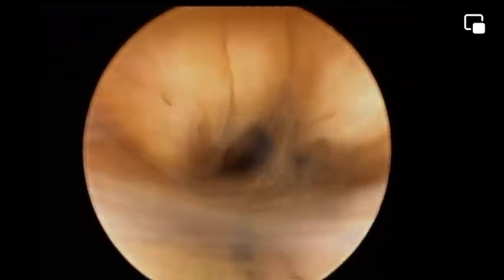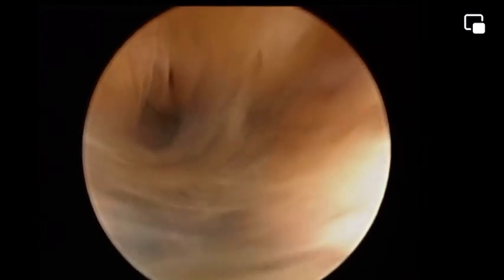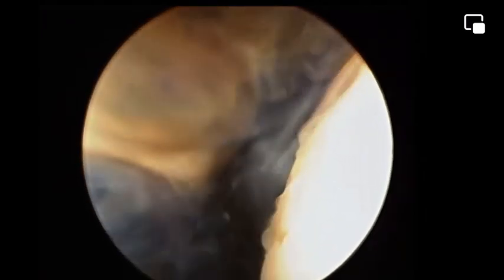Follow the lines of the endocervical canal. They look like tram lines or railroad lines. This is your landmark or your guide to know the direction to the internal os. Approaching the internal os, it's very dark because there is a lot of blood collection in the pouch of the cesarean scar defect. Here, you see that?